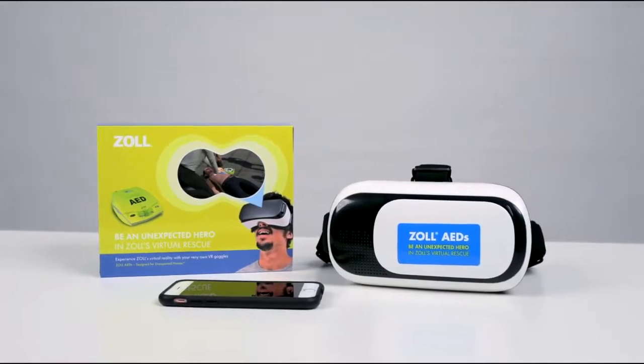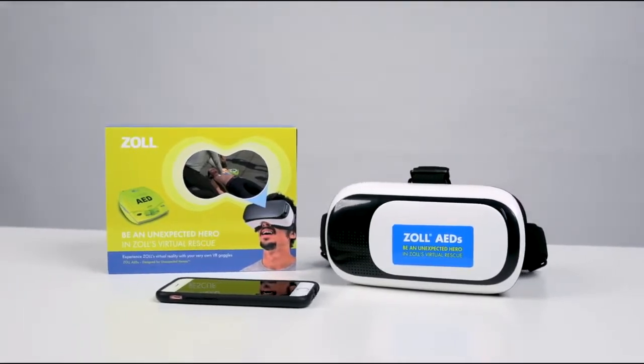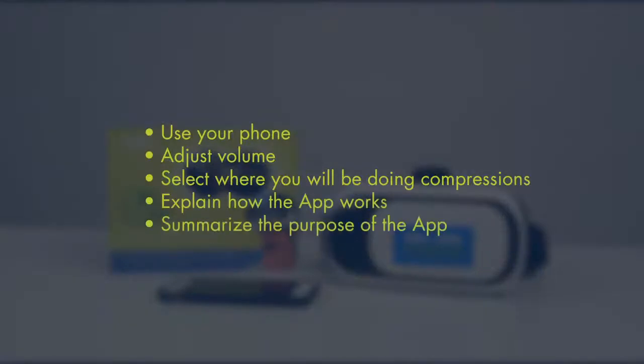A few tips to help ensure that your VR demonstration goes smoothly. Use your own phone. The app is already loaded on it and you are familiar with it. Ensure your volume is turned up to the desired level before placing your phone in the goggles. Decide where you're going to do compressions, such as on a mannequin, on the back of a chair, or on a table. Explain to the customer that the app measures head movement from the phone, and to be sure to move their head when compressions begin, and to look down to see the victim.